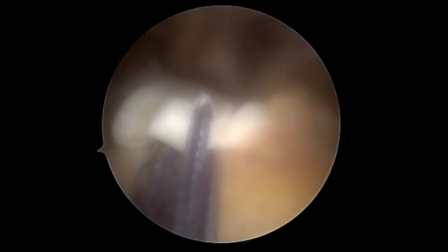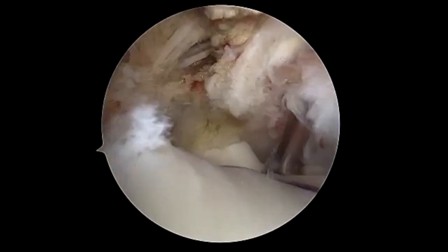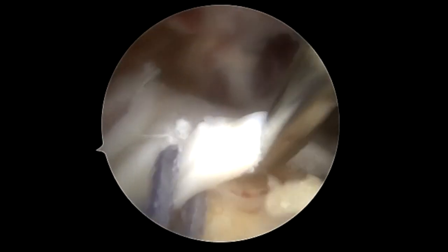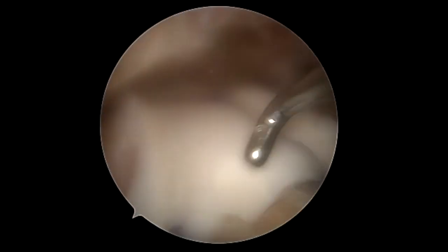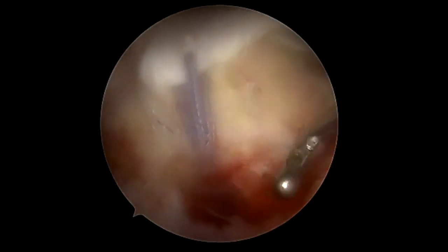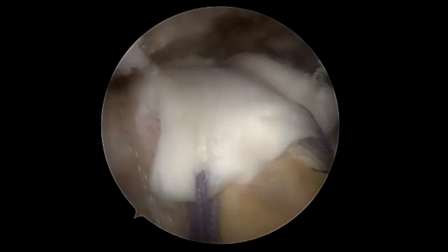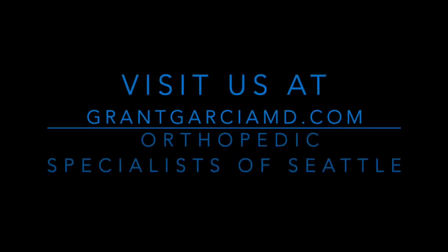Finally you can see us rotating back and forth, retentioning one more time and making sure that the cuff patch is placed well over the repair site. You can see there is no mobility of this patch — it is nicely compressed down and upon probing is in excellent position. This will help enhance our healing and reduce retear rates; we've seen good vascularity in these patches. The rehab protocol can be the same as a standard rotator cuff repair in this situation.